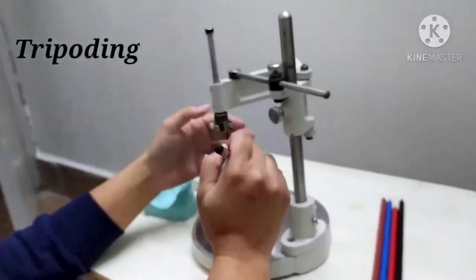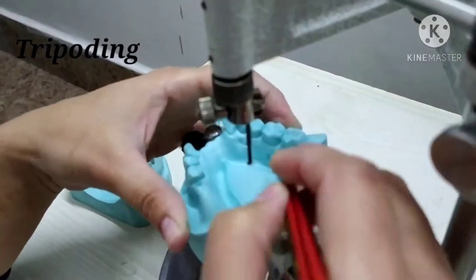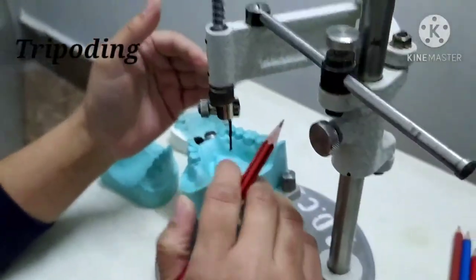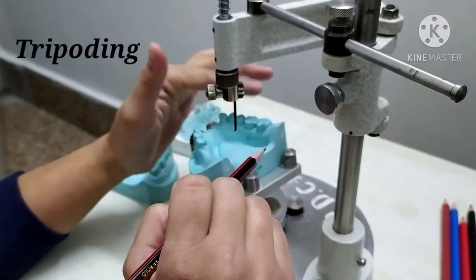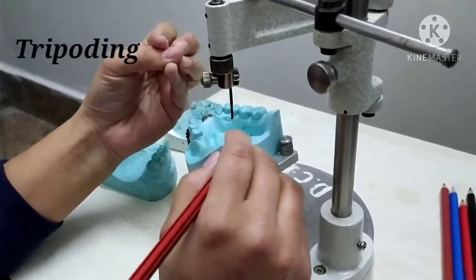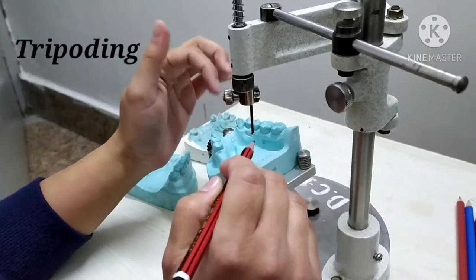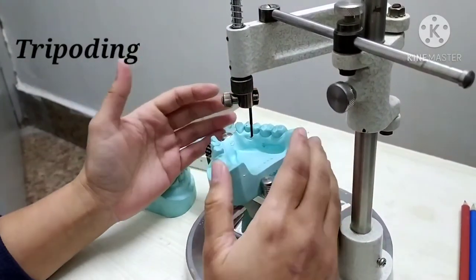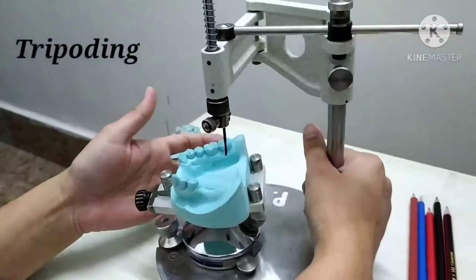Once the cast area has been scribed, it has to be marked with a small cross line so that it is visible. The carbon marker can be placed at a 45-degree angle to mark the three tripod lines, or an undercut gauge can be used to scribe the cast area. The advantage of scribing is that if pencil marks wash off due to wetting of the cast, the scribed lines are retained. This is the purpose of tripoding — to record the horizontal tilt of the cast.